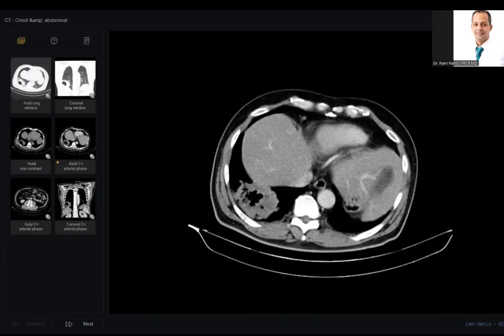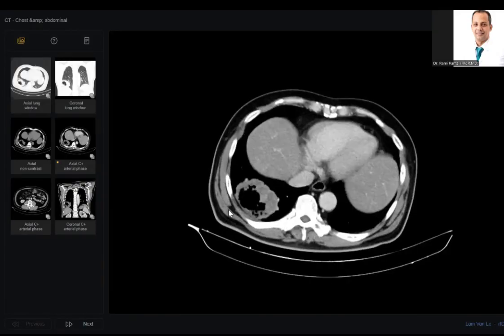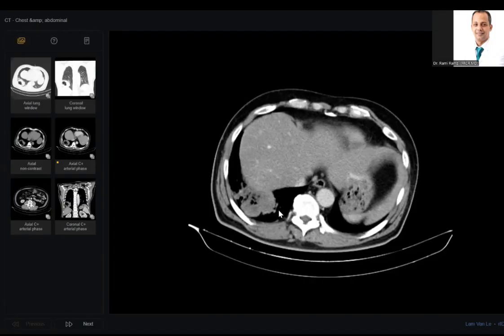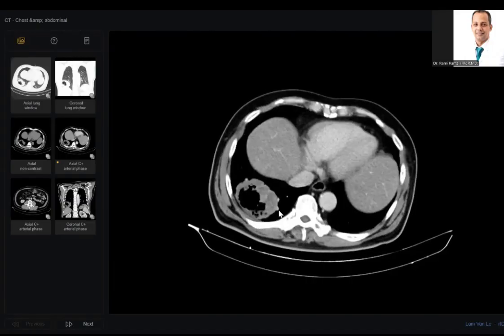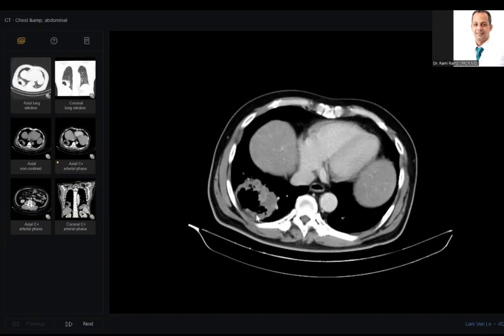You will avoid the rib, either here or here, like this, for example. You can go from here or down, like from here. This is very good, by the way. You can make the needle along this axis and take.